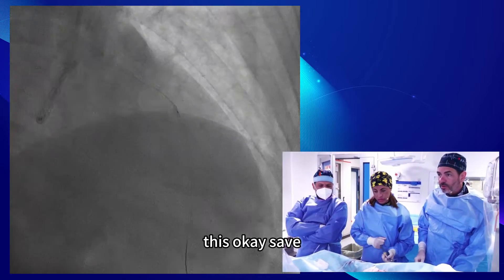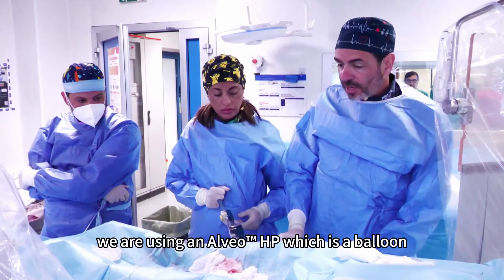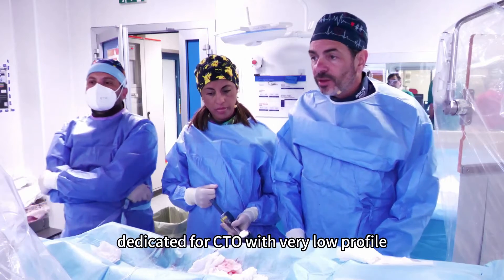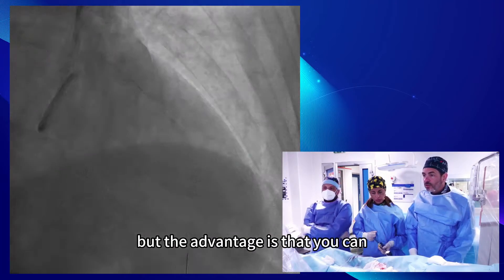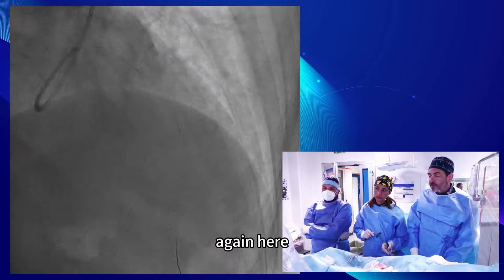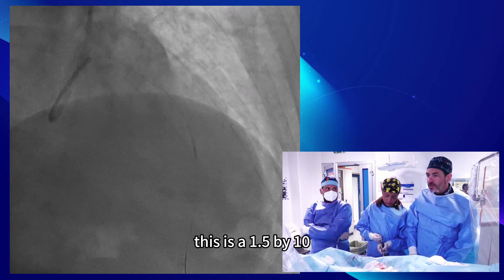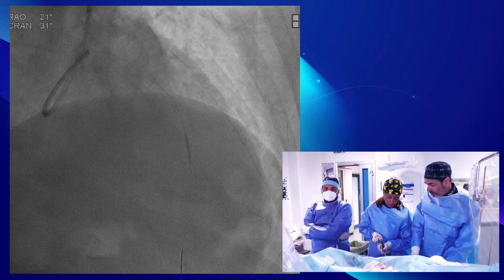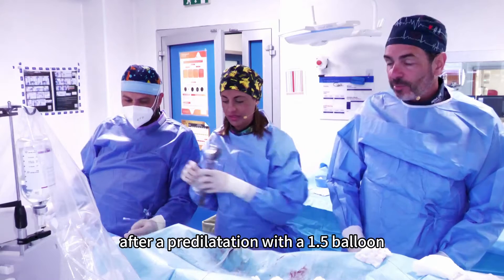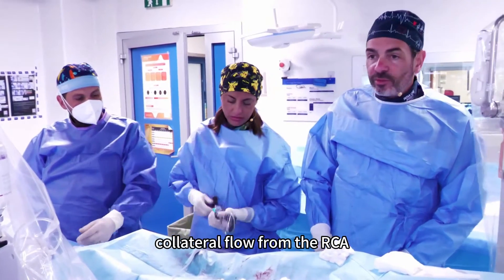Now we are dealing with the lesion. We are using an Alveo HP, a balloon dedicated for CTO with a very low profile, but the advantage is that you can also use it at high pressures — up to 20 atmospheres. This is a 1.5 by 10. After predilation with the 1.5 balloon, the vessel is still not open, but as I said, there is a collateral flow from the RCA, so there is some competitive flow.